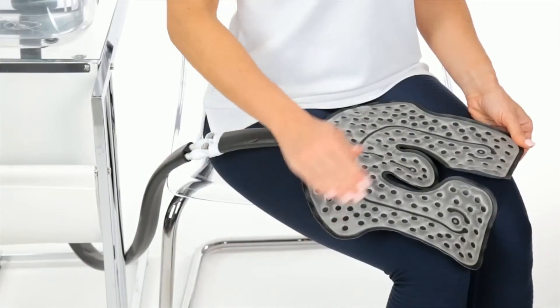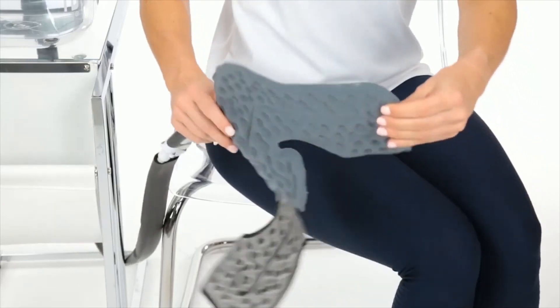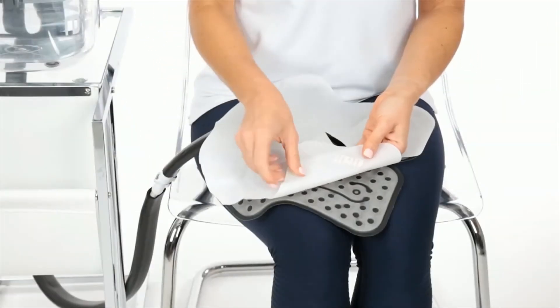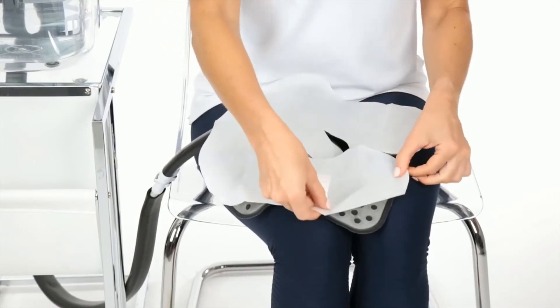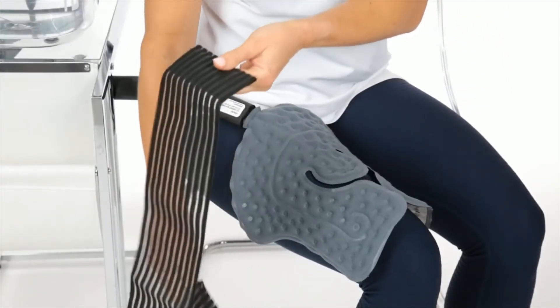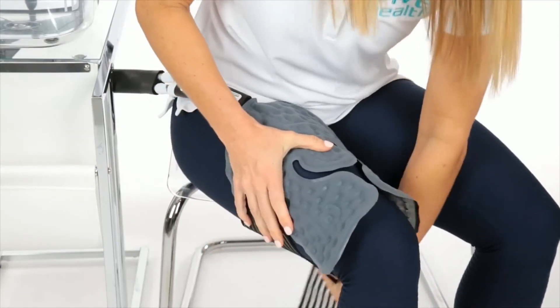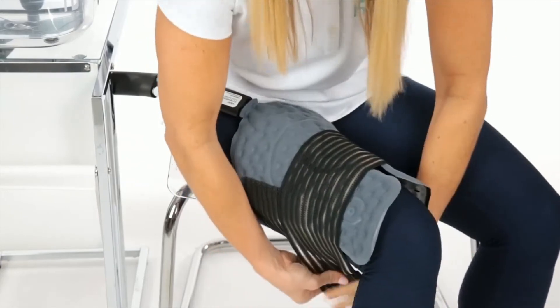To apply, position the clear side of the pad against the area that needs the cold therapy treatment. To attach the optional protective barrier, remove the adhesive and attach it to the clear side of the cold therapy pad. For a secure fit and added compression, wrap one of the adjustable velcro straps around the pad to keep it in place.